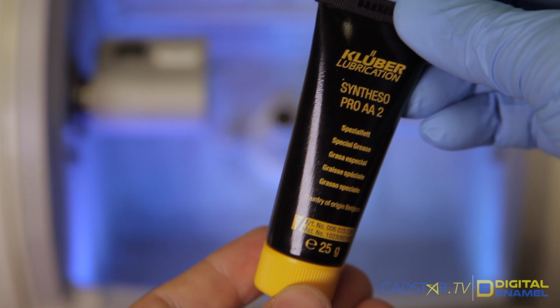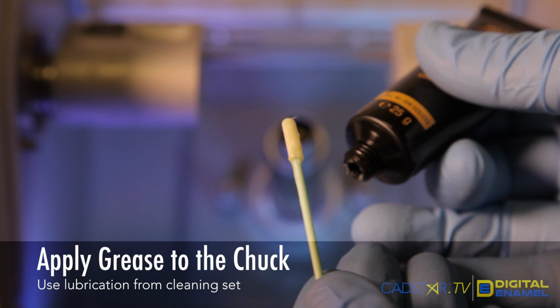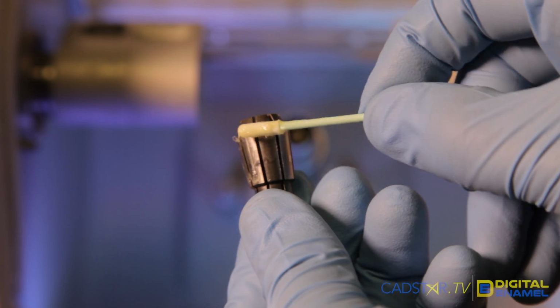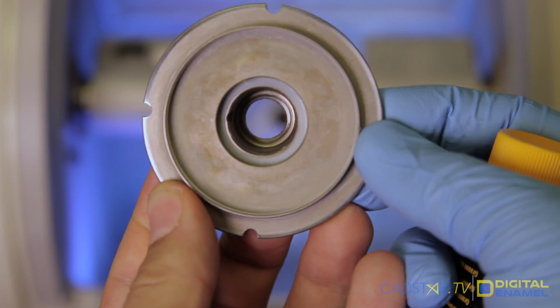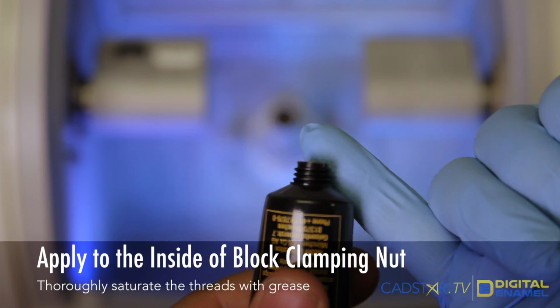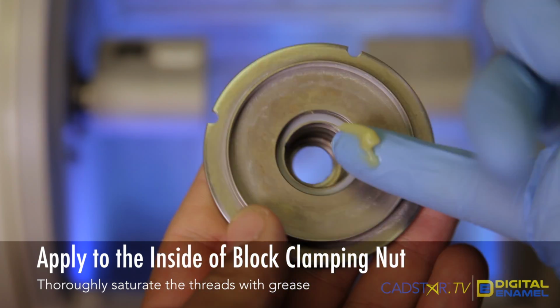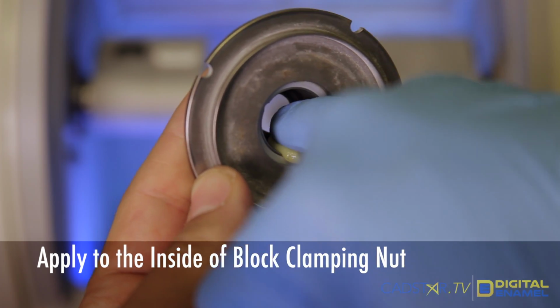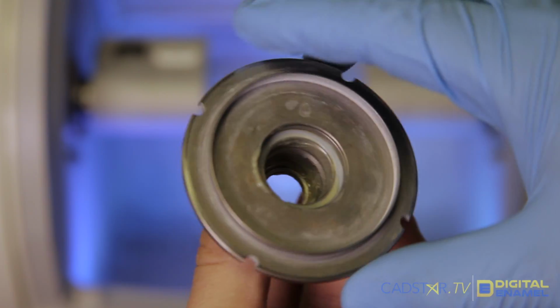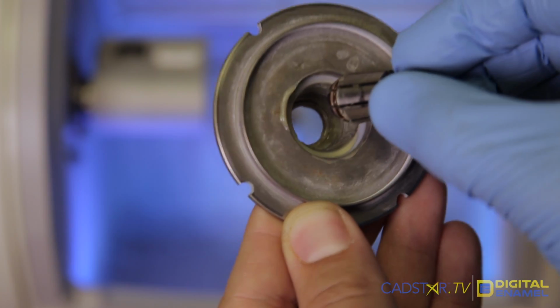Now that everything's been cleaned, we take the lubrication that comes with the cleaning set, take the rounded off cotton swab, and lightly coat all of these pieces. We're coating the chuck as well as the inside of the block clamp. Now this, we're going to be a little more generous with our application. So you see, squirt a little bit on your pinky, and this way you can thoroughly spread all the lubrication around the inside of the block clamp. You can see there that we have quite a bit of grease, but we want these threads to be saturated very well. We're going to put everything back together.